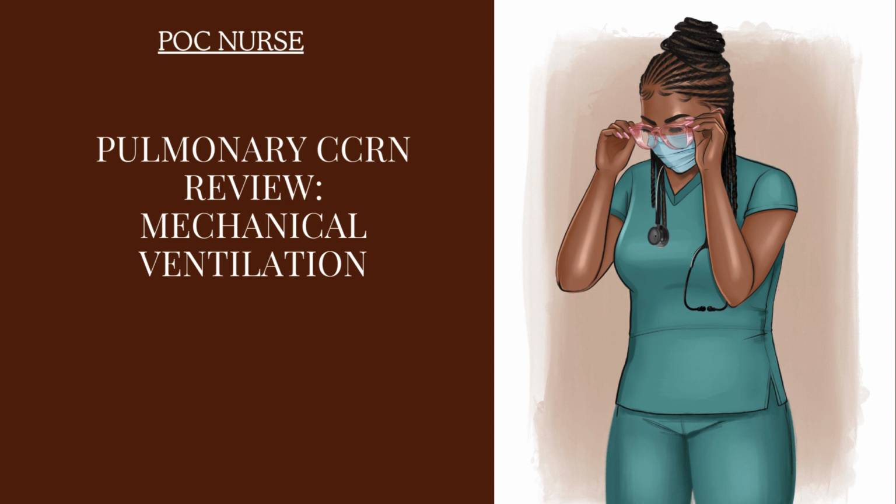If there's inadequate tidal volume going into the patient for whatever reason, the low pressure limit alarm could go off. If the patient has a chest tube and there's a leak in the chest tube, the low pressure alarm could go off. So these are some reasons why we could get a low pressure limit alarm in the mechanically ventilated patient.